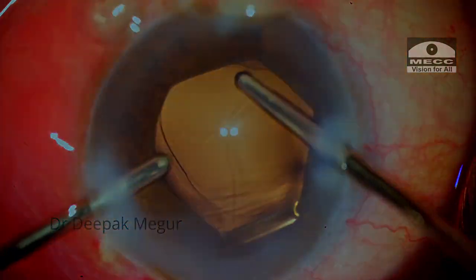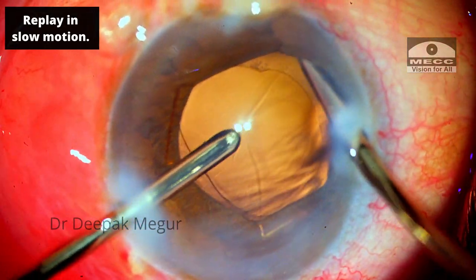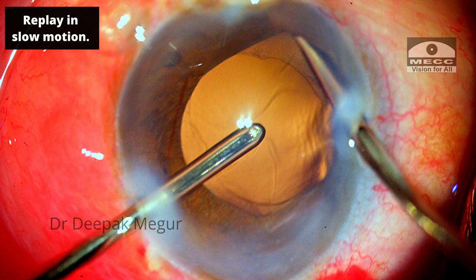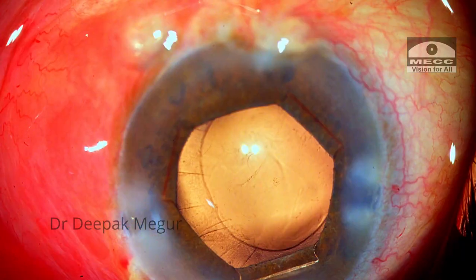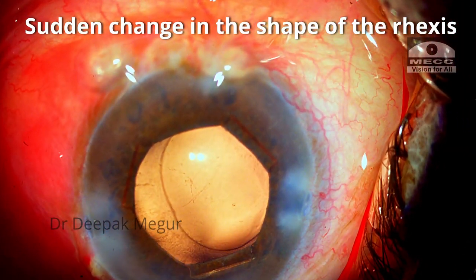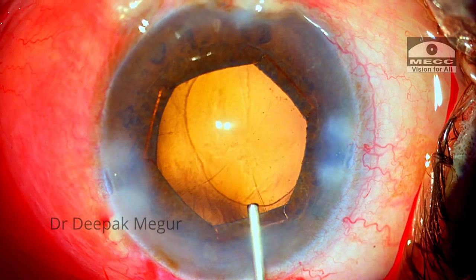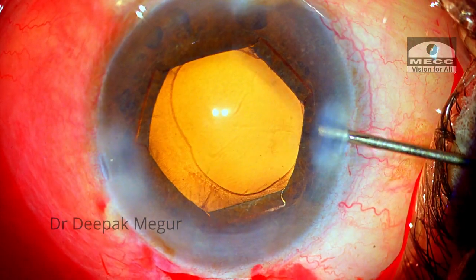At this moment, something interesting happens. I am trying to lift the iris and suddenly see some wave, though it was not very obvious during live surgery. On replay, I can make out that fluid has probably passed across the zonules in that particular area posteriorly into the Berger's space. During the surgery I did notice a sudden change in the shape of the rhexis — it has become slightly eccentric. This happened probably because of a localized zonular defect induced by the sudden fluid passing across it.